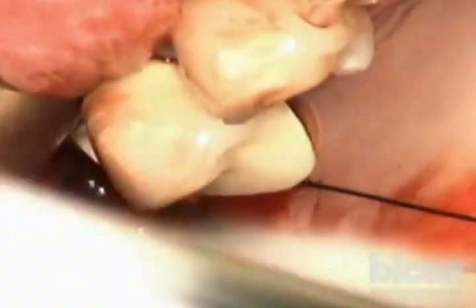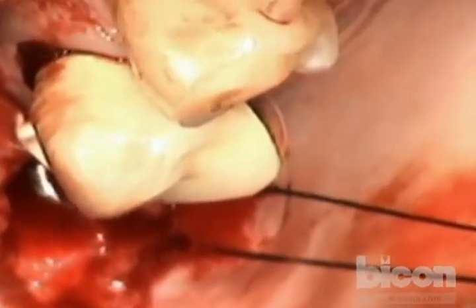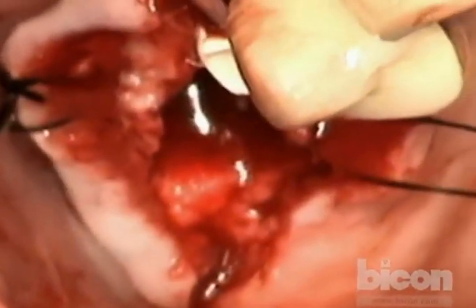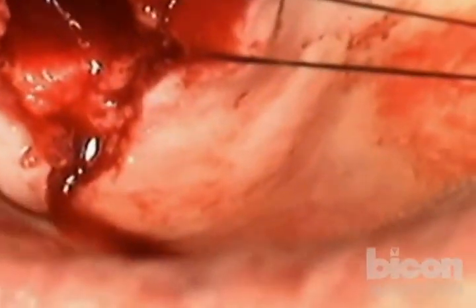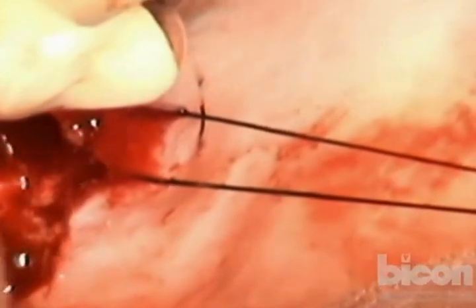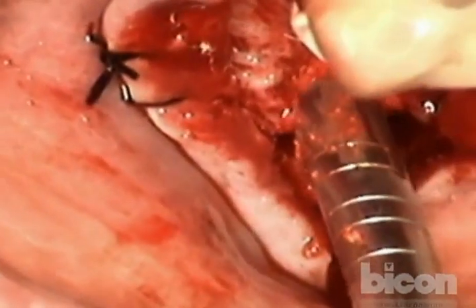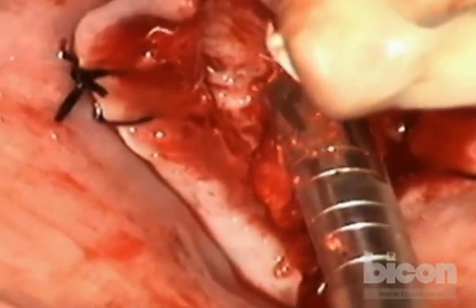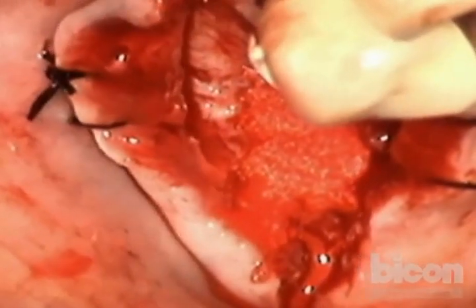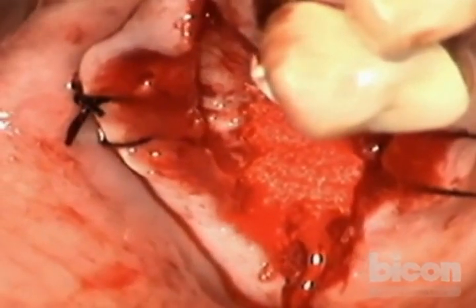Now we'll use a metal syringe to carry the graft into the sinus. And as you can see, we've used less than a gram of graft, whereas a sinus lift, even of the smallest size, would have cost you at least 2 grams, if not 3 or 4, of graft material. In this day and age, every little bit helps. The technique is a little bit more challenging, but it will cut down on healing time for the patient.